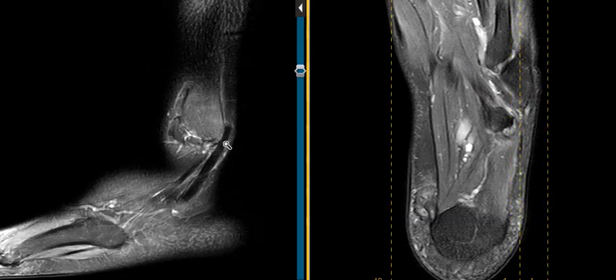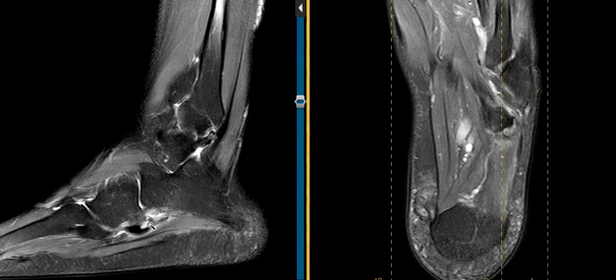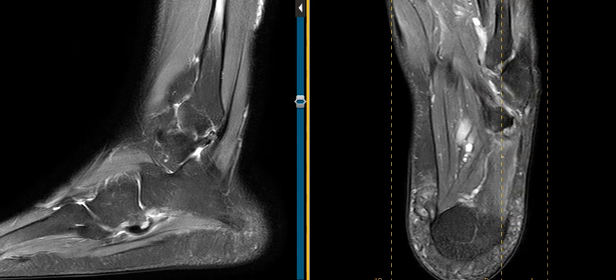We're going to put up another view to troubleshoot. Back to the sagittal — the peroneus longus is going to be the bigger one back here. It's going to come down, go around that peroneal tubercle, and shoot right across here. Again, this is the segment that looks abnormal — it's ill-defined, bright, thickened, and there's a little bright area right here. This is very unusual. The question is: is this a partial tear, or could it be something else?